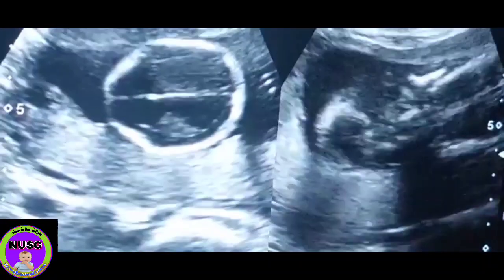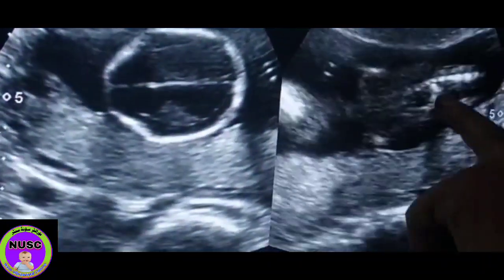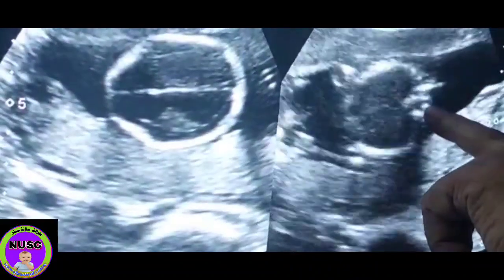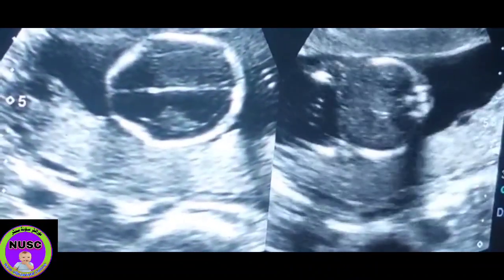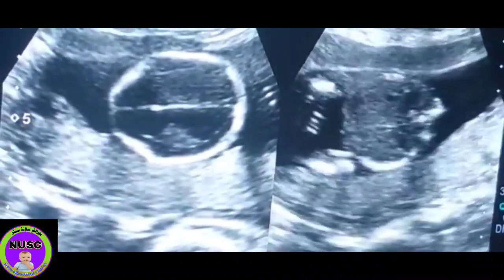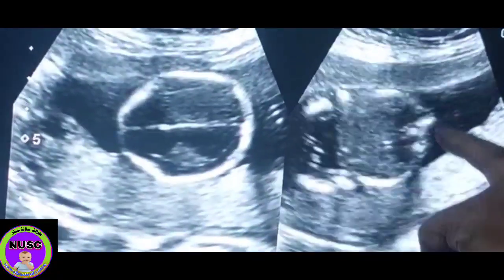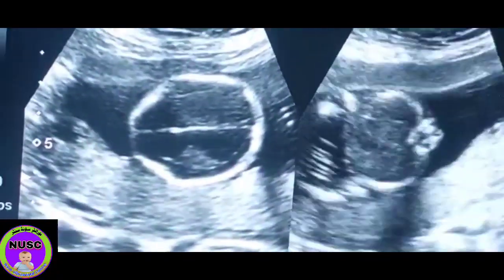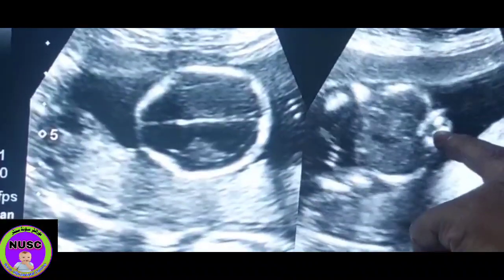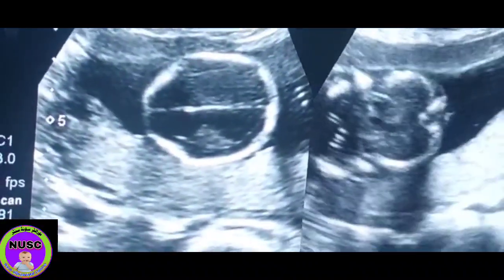Now we see the fetal spine. Here you see, this is open spina bifida — the cup sign. And this is the spina bifida.